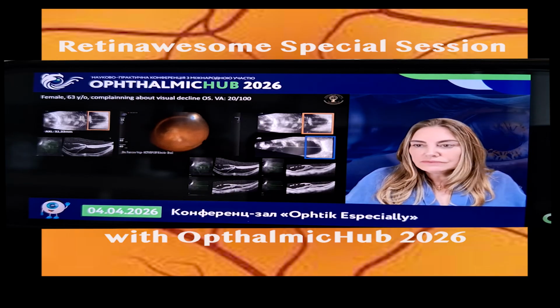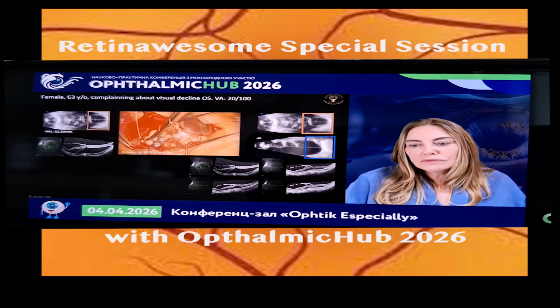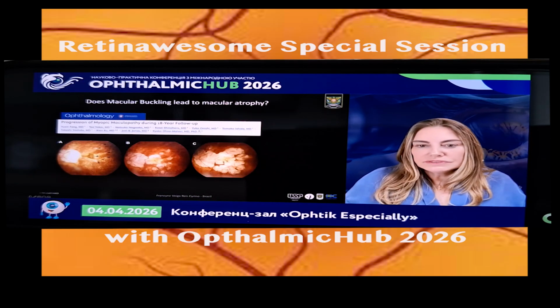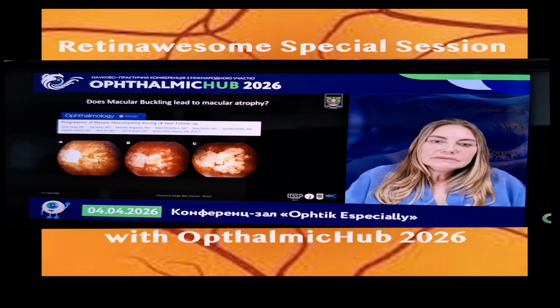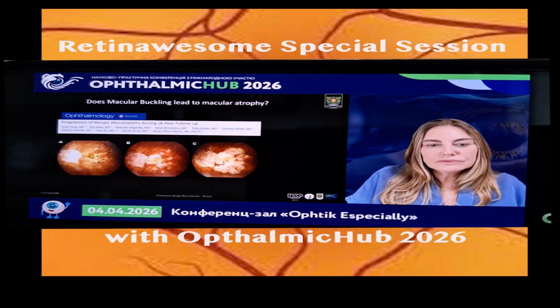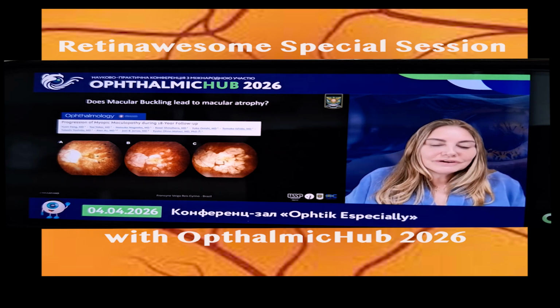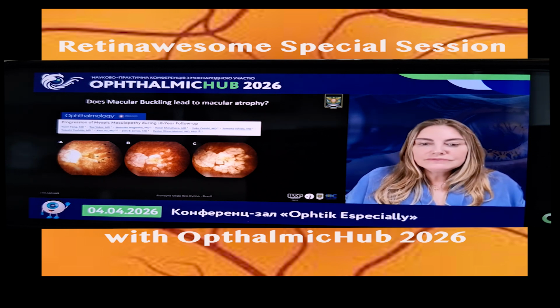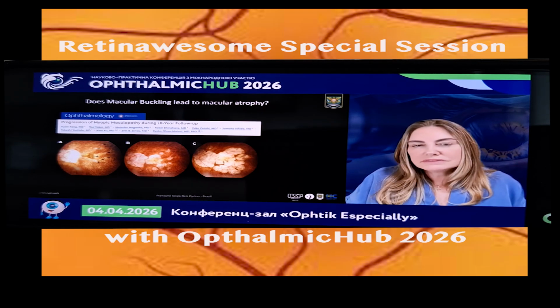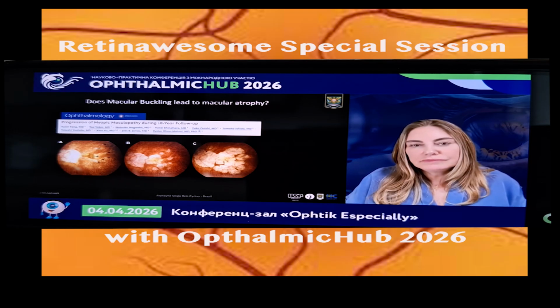the objective is to reduce, like you can see here, the staphyloma, and then slowly the anatomy goes back to the right position. And for those who think that macular buckle leads to macular atrophy, the group of Professor Ohno-Matsui has shown, and as Curtin has shown us very long before, that there is progressive macular atrophy in high myopia eyes, and it doesn't have any correlation to macular buckle.